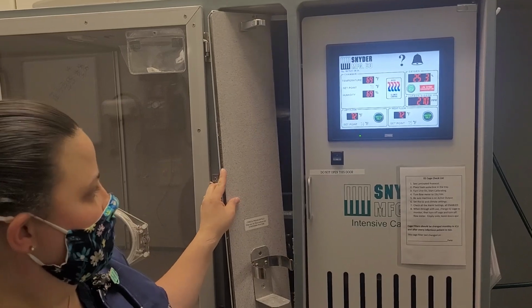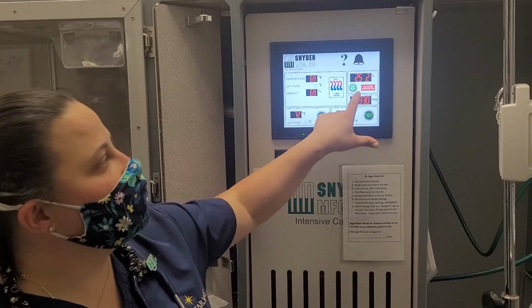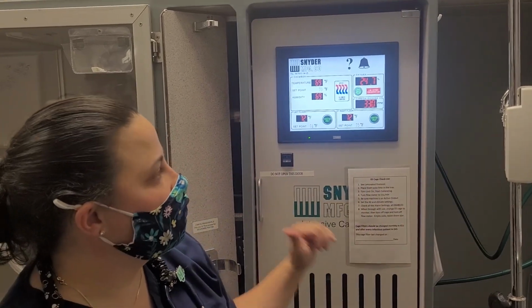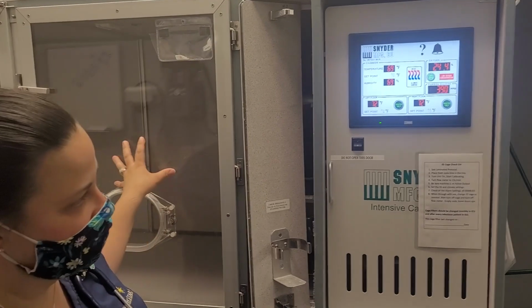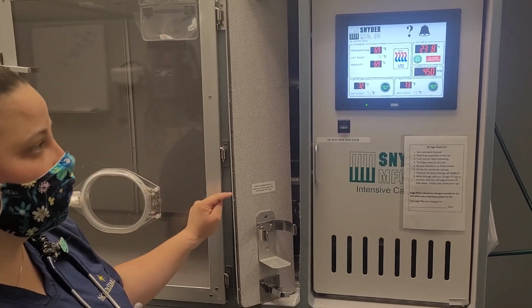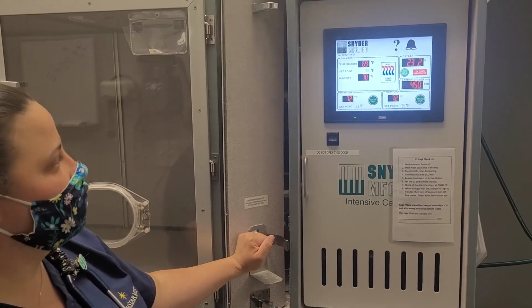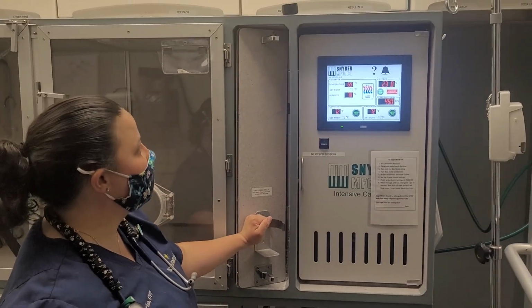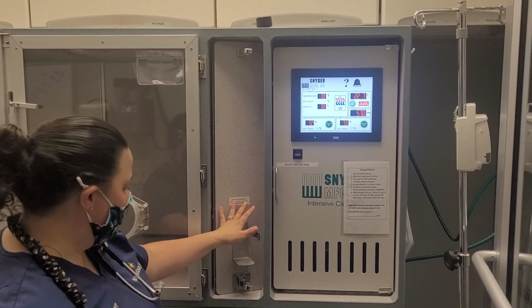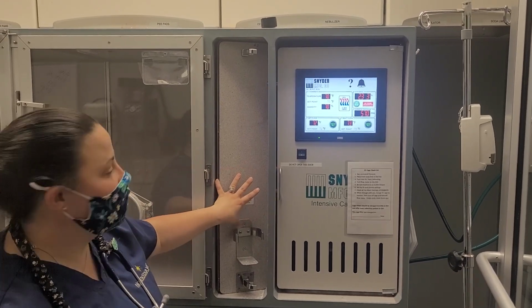So if your oxygen isn't holding, your percentage isn't holding to where it's supposed to be, or it suddenly starts to drop, you may have a leak in your cage or your chamber. So steps you want to take to make sure that everything is sealed appropriately. You want to make sure that your cage door, the B door, is actually closed and latched tightly. If it's not latched tightly and not closed, it doesn't form a correct seal and it will leak.